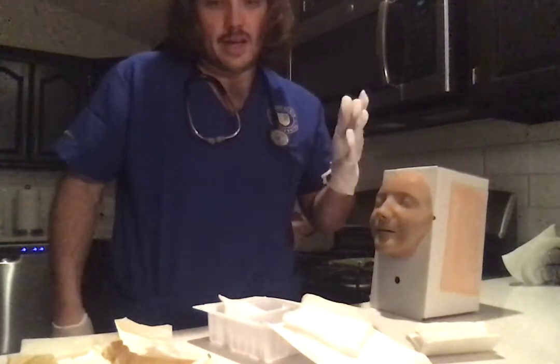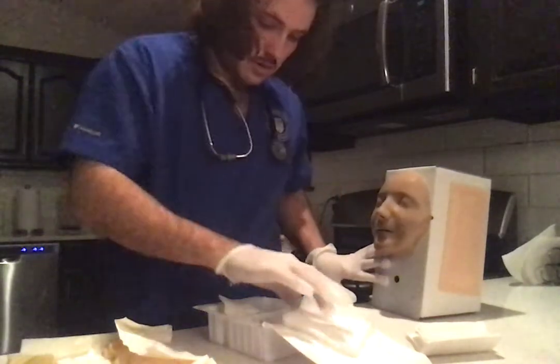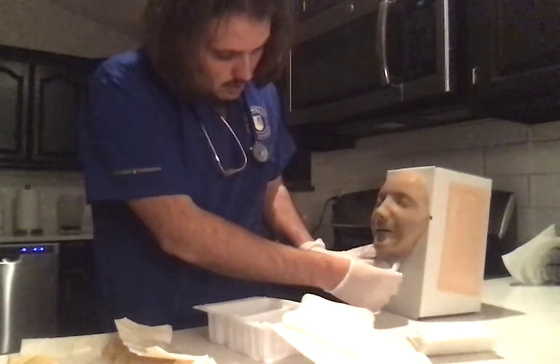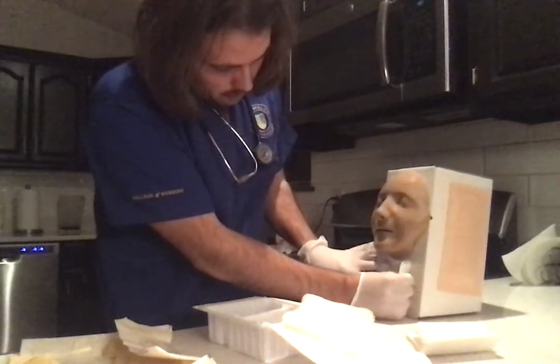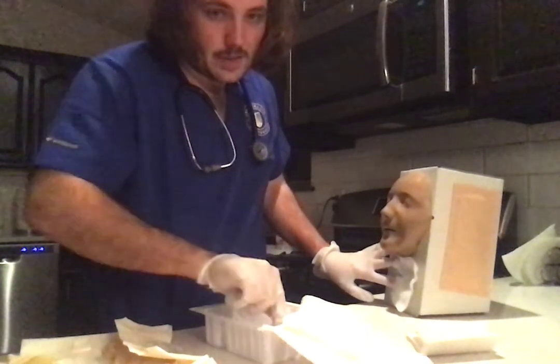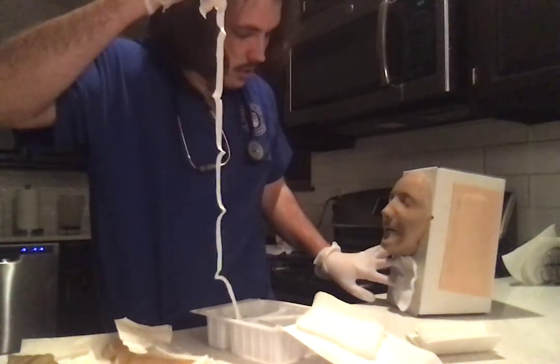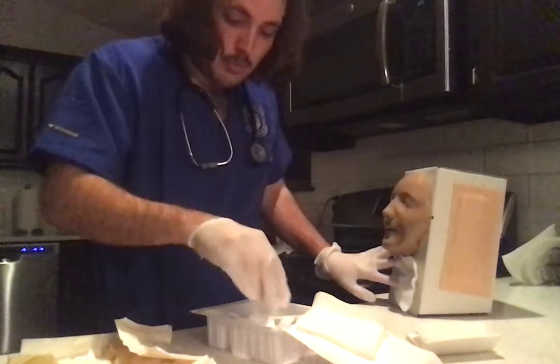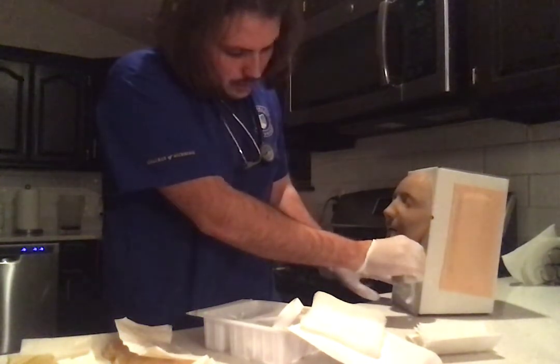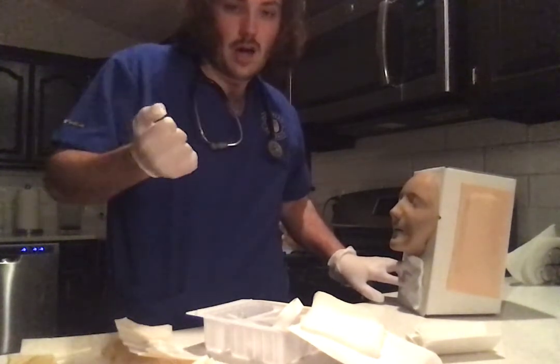So then we would stabilize our new trach with our non-dominant hand. Hold that there as we take our fenestrated dressing and put that on. Once that is ready and stabilized, we would replace the trach ties. Can't really do that right now since I don't have a trach. But we would replace the ties through the eye of the trach, and then once that's almost secure, we would remove the old and finish the new knot with a square knot.